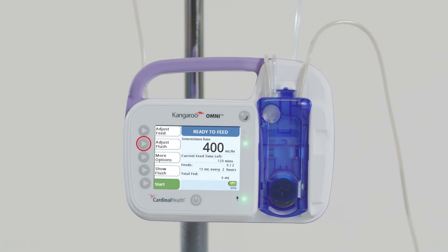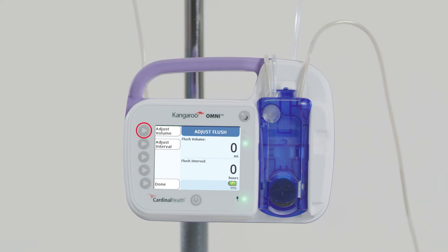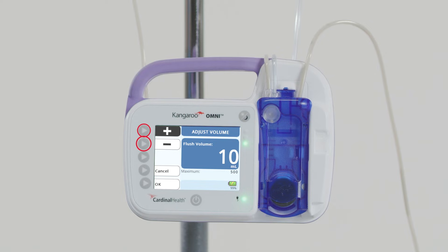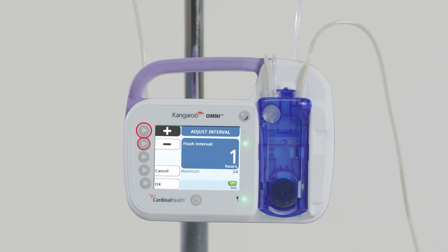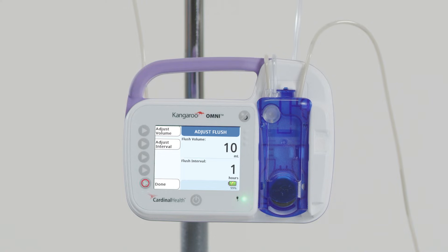If applicable, you can adjust flush. Press Adjust Flush, then Adjust Volume, and use the plus and minus buttons to input the desired flush volume. Press OK to confirm the flush volume and return to the Adjust Flush screen. Press Adjust Interval, then use the plus and minus buttons to input the desired time interval. Press OK to confirm, then press Done to return to the Ready to Feed screen.